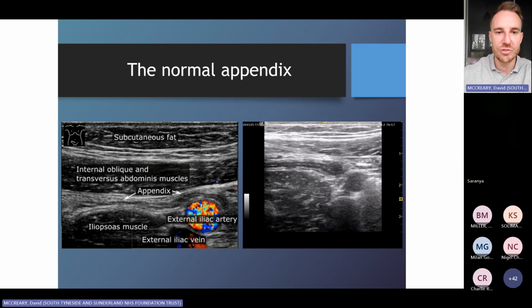You might see movement from breathing, but if we have this loop here and an adjacent loop over here, which we did in the previous example, you'll see classical peristalsis happening like that, and then you'll see a little loop next to it and nothing's happening. We're waiting and waiting for maybe 20 or 30 seconds, and nothing happens in the appendix.